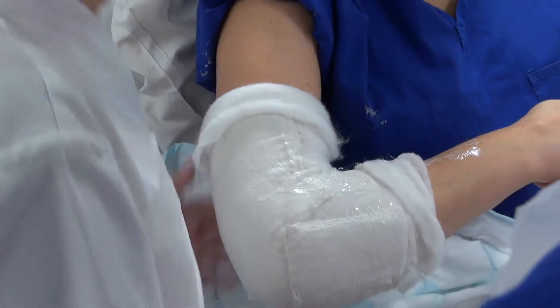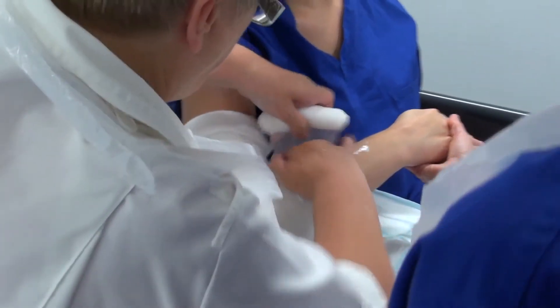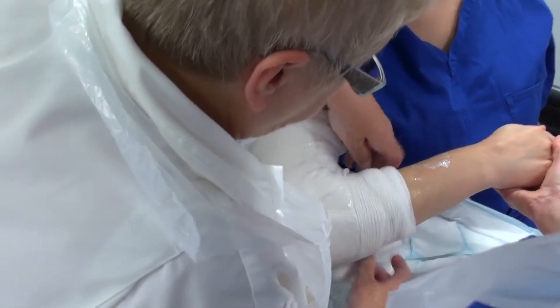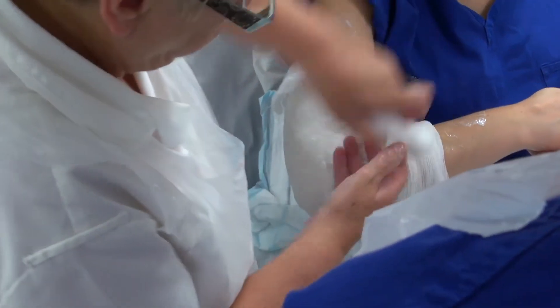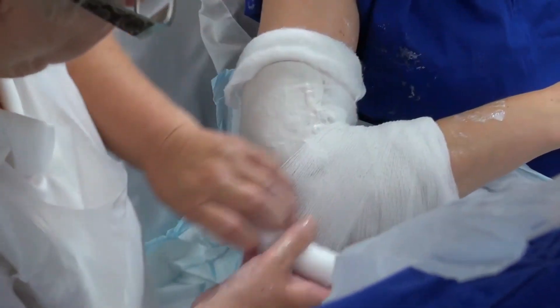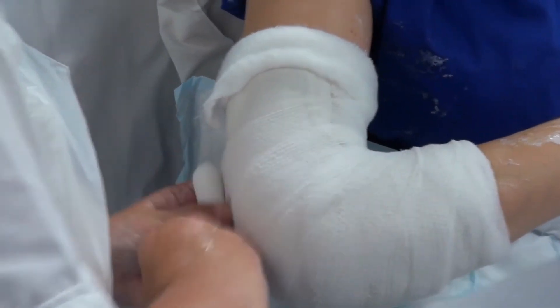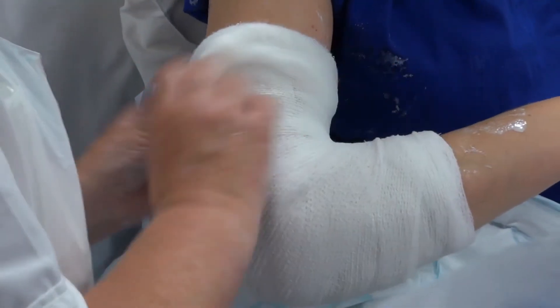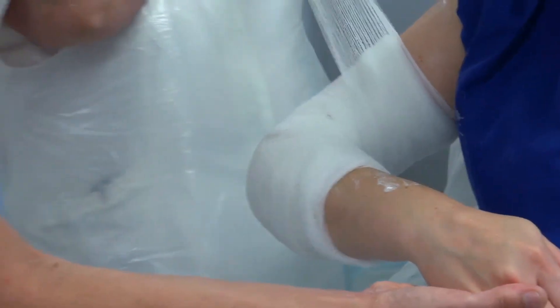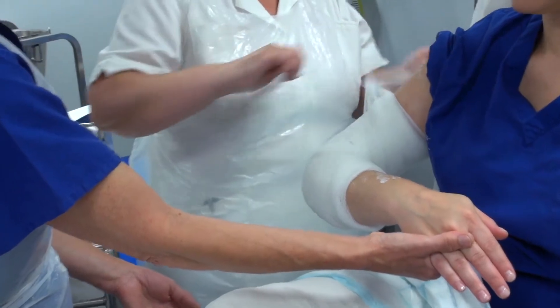I'm just turning back the edges now, and she's going to apply a pre-shrunk bandage just to hold the plaster in place. It's just going to be tied off.